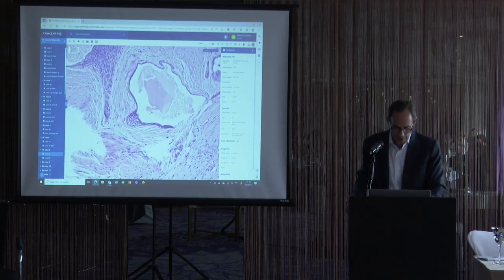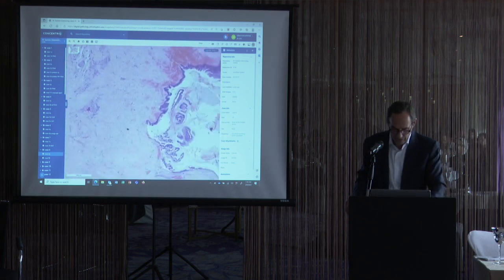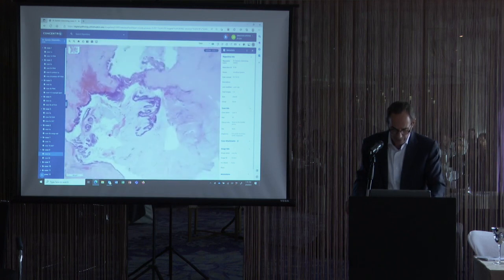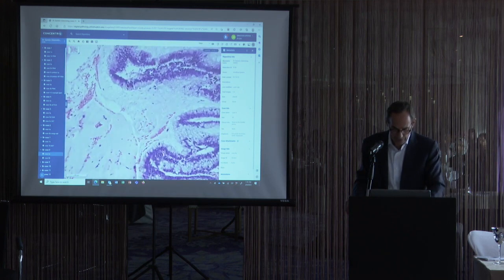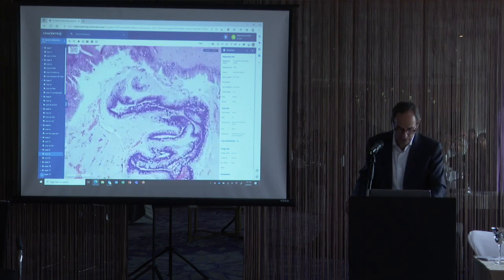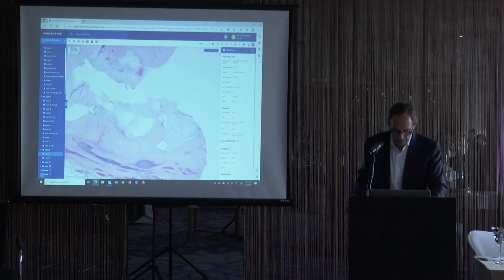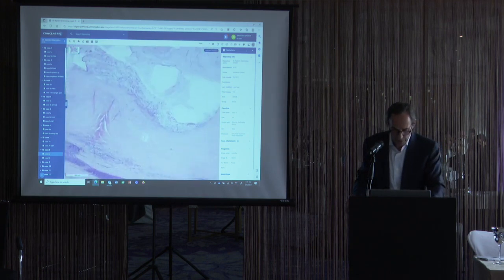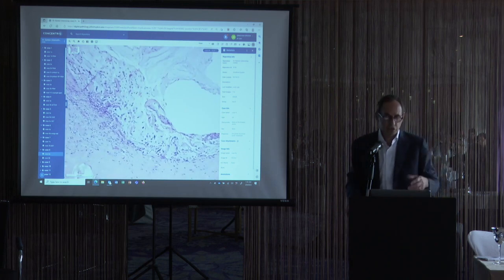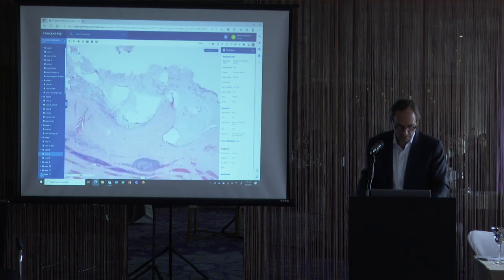Here's again part of our normal urachus. What we can see here is this normal urachus now ending up in this mucinous neoplasm. The mucinous neoplasm is lined by mucinous goblet cell epithelium with some atypical nuclei next to it. But it's not overtly invasive. There's some mucin extravasation here, but if you look at this mucin, it's acellular mucin. There's no invasive adenocarcinoma component. There's no epithelium floating in the mucin or lining this irregular mucin.